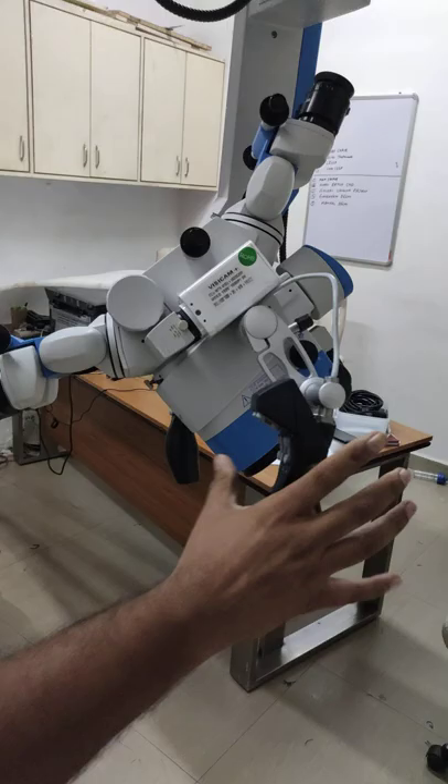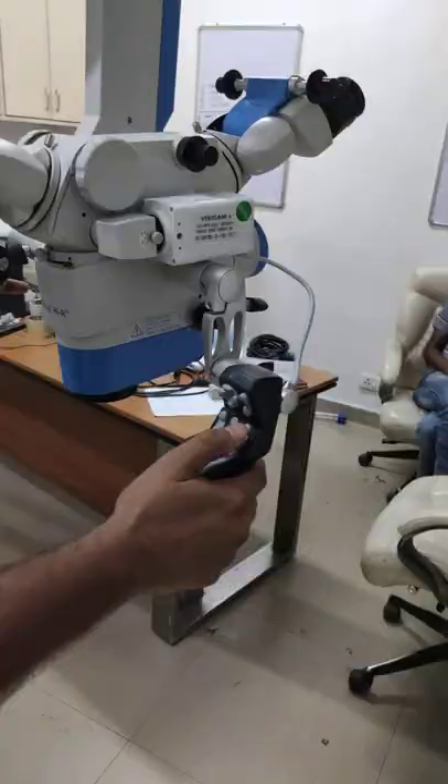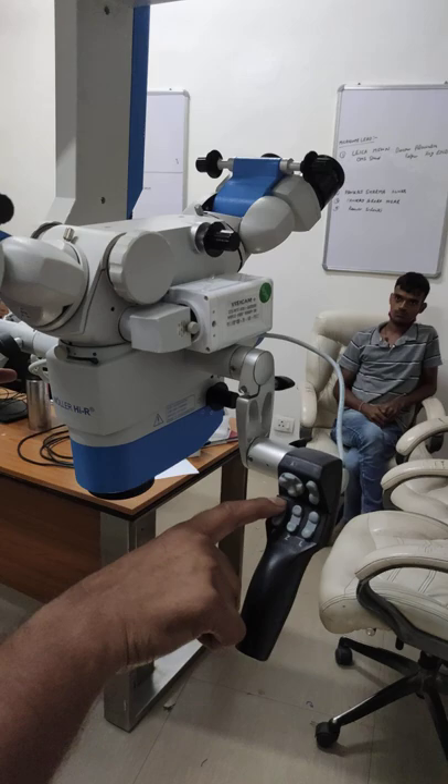It is very easy to focus inside deep cavities. These are the motorized grip controls — you can focus from here, zoom out or zoom in from here, and also control the light intensity from here.